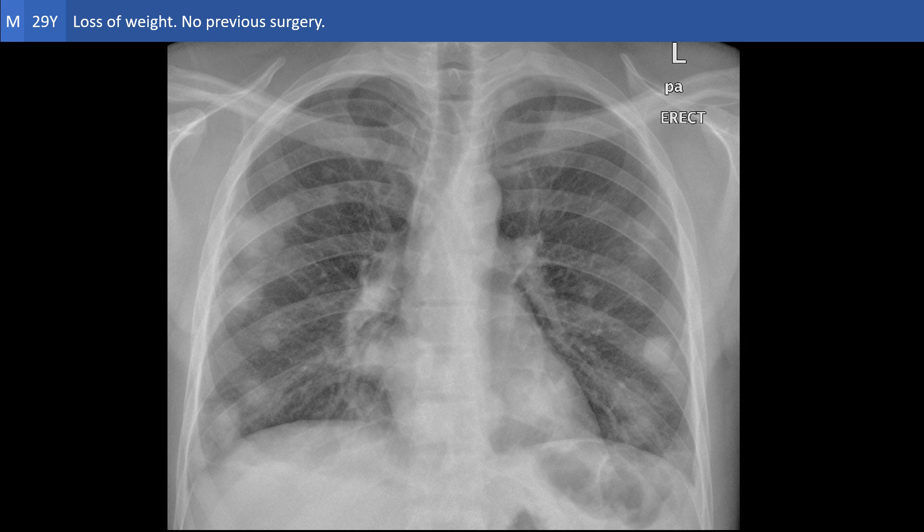Welcome to the body imaging cases. This is the chest X-ray of a male patient with unexplained weight loss. It shows numerous rounded lesions of both lungs. Metastasis should be the first consideration here, particularly in view of the weight loss.